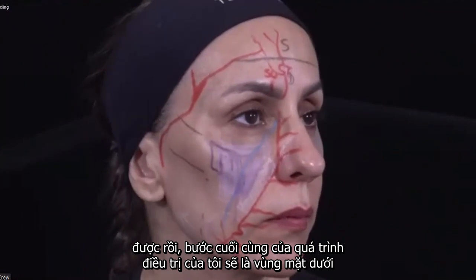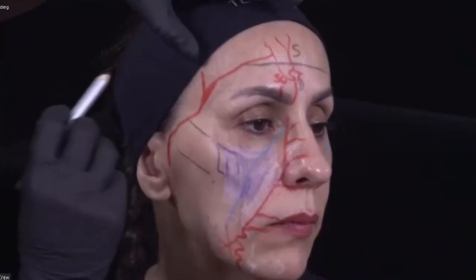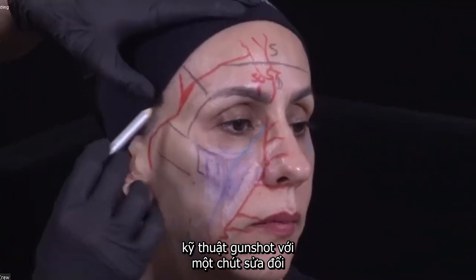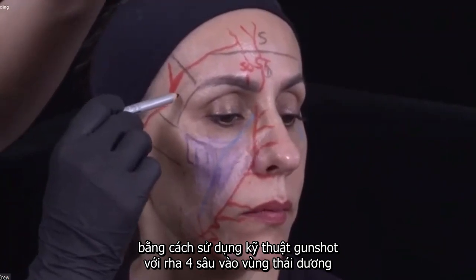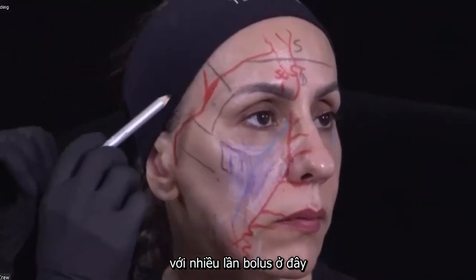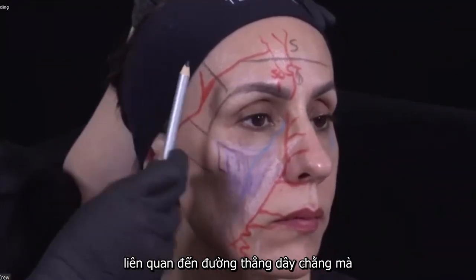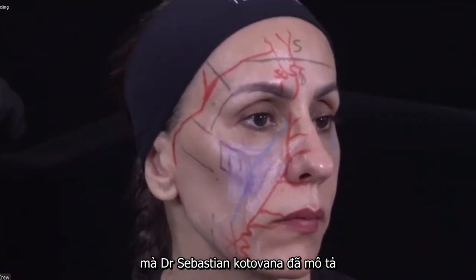Okay. The last step of my treatment will be the lower face. But before, we will use a slightly modified gunshot technique with RHA4 deep into the temple with multiple boluses here. That will make it easy to also lift the lower face with injection in the temple, regarding this line of ligaments that Dr. Sebastian Cotofana has already described.